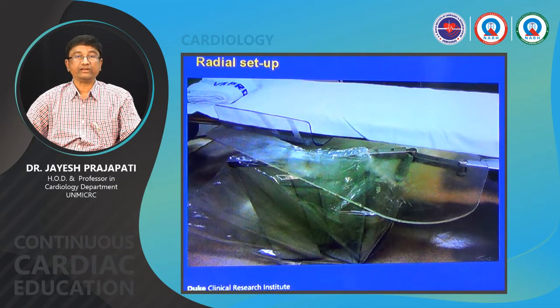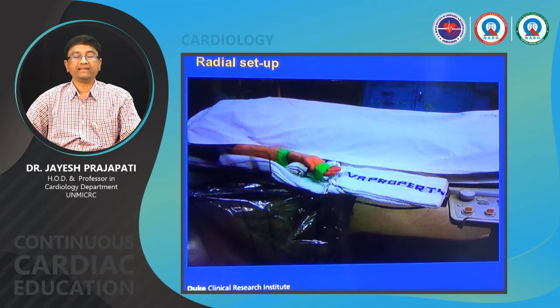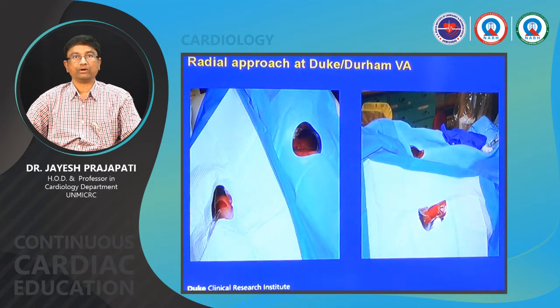During the radial procedure you have to be comfortable enough. That is the important thing, because with femoral we are more comfortable. With radial also, because of such a setup, you should make yourself comfortable. Some people think that radiation is a little more, and people say there are some advantages and disadvantages, but with experience that also goes down. So if you are comfortable with such a setup, then radial procedures are very easy. It is comfortable for the patient, and convenient for the doctor also.